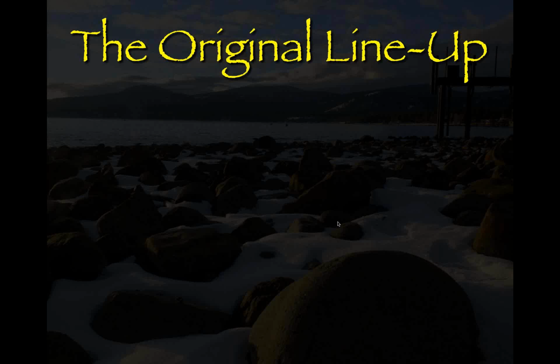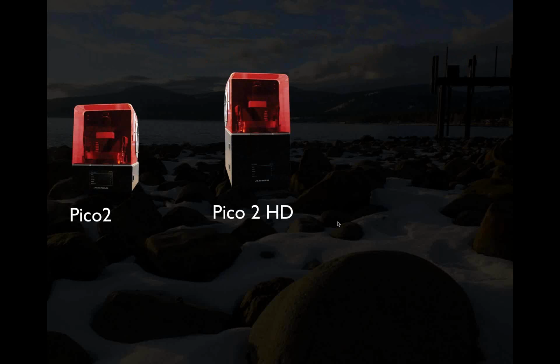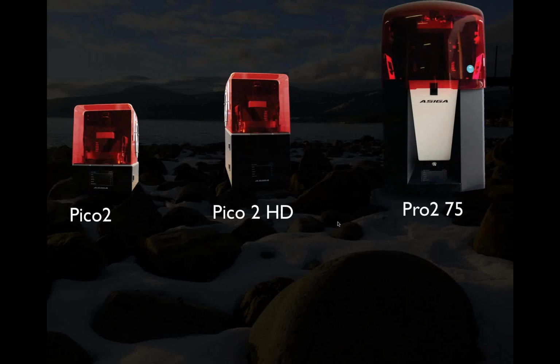So when we're looking at the lineup of the Asiga printers, the original lineup was these 3. And then we're going to talk about something else here a little bit that's new on the horizon. The Pico 2, the Pico 2 HD, and the Pro 2. Okay, and these sizes are relatively accurate. And the Pro 2 is a big machine. It's almost 3 feet tall. So it has a pretty big footprint, worth keeping in mind.